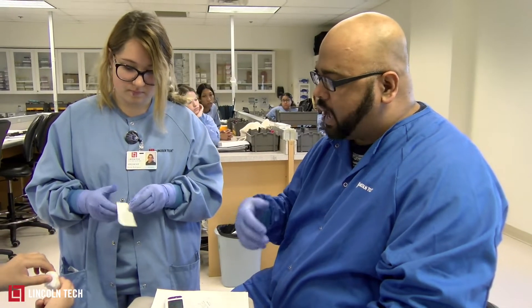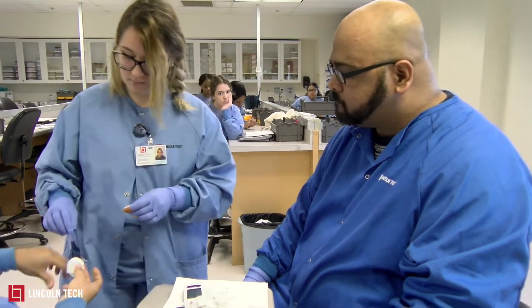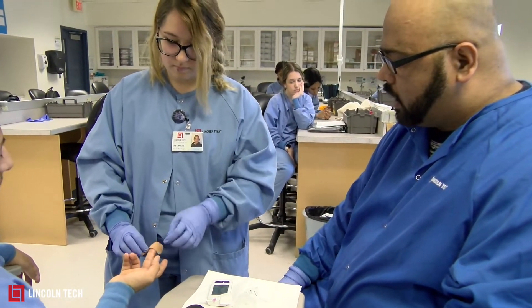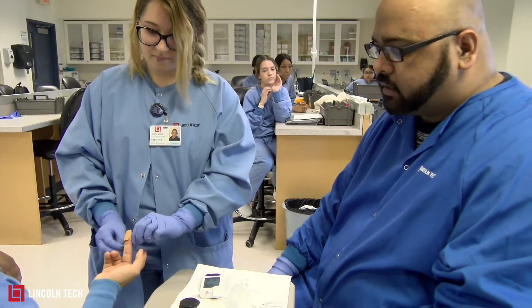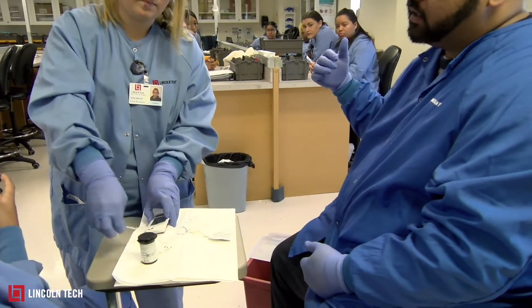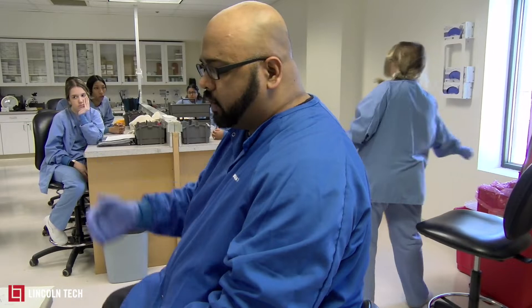When she's done, she's going to give the patient a band-aid and take away the gauze pad. After that, she'll do proper cleaning: anything that has blood on it goes into the biohazard, and anything that doesn't have blood on it goes into the regular garbage.